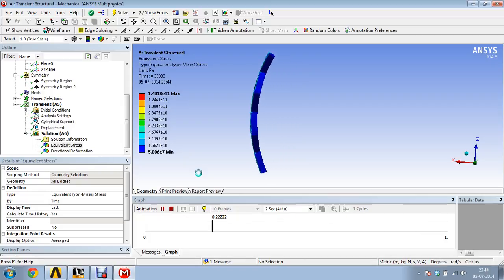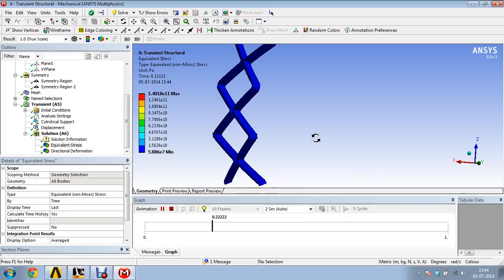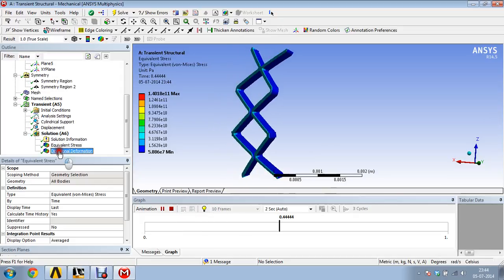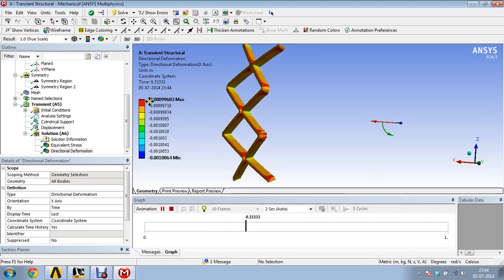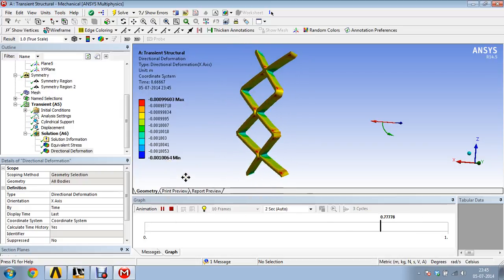So you can very much clearly see how it is compressing, and due to an axisymmetric boundary condition, it is compressing like this. Okay, so it is very clear how it is compressing. You can see the directional deformations also, and you can see that the directional deformations are around 1 mm because we have given 1 mm, so there would be some 1 mm deformation, and this is minimum.